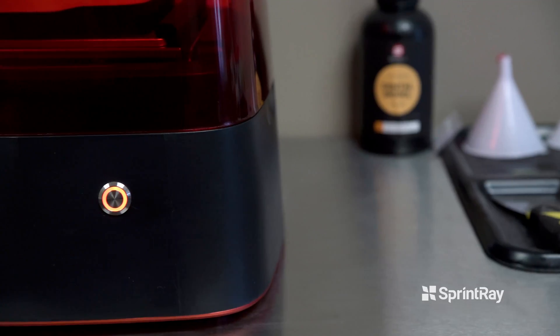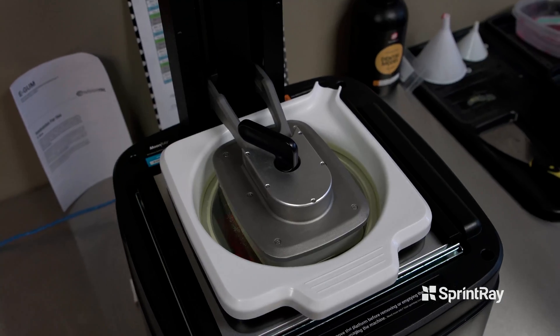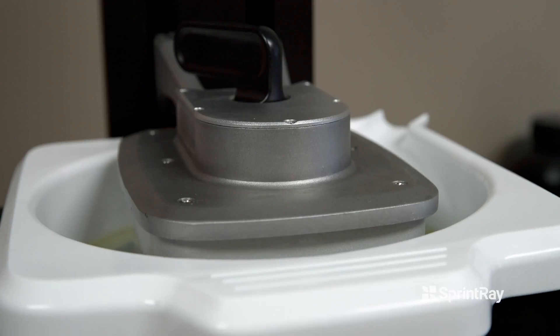I can't stress enough how important it is to us to be able to offer our doctors printers that they can afford, so they can now do a lot of this printing themselves. We've used other 3D printers and their software is not that easy to use — it takes a while to load up a job before you even start printing. With the Moonray software, it's very easy to load the trays and our printed parts and then immediately get them printing.